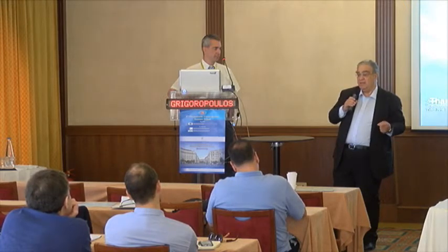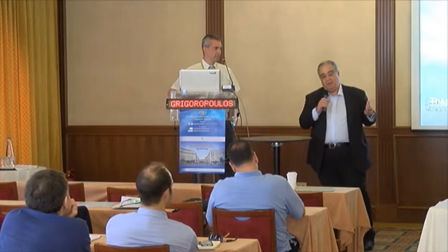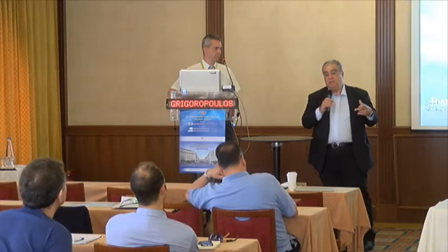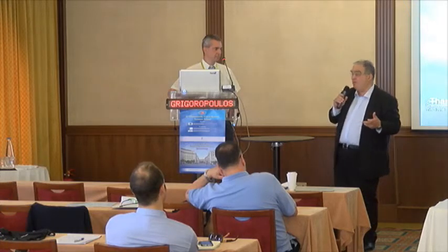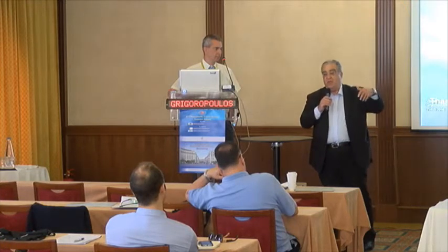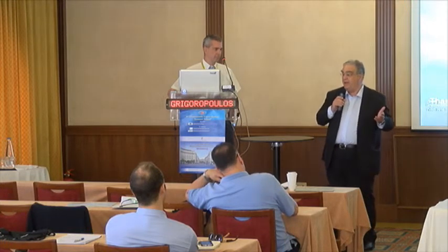The second thing is the combination. I'm using 3D heads-up display, and you know everybody is. The most important issue, except seeing things in haze, the mechanical vision as they call it, is the one that you showed us today, beautifully done by Eckhart, that you can superimpose things on the screen and you can do things combined that lessen the danger of making mistakes in the eye.